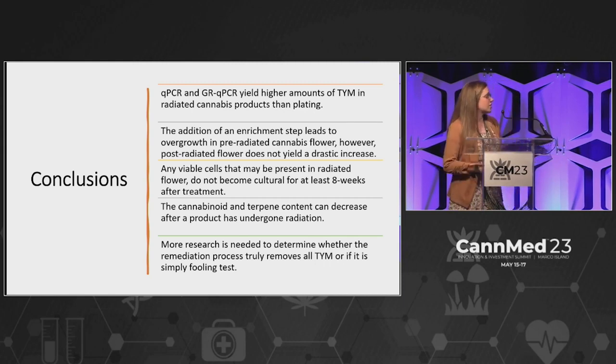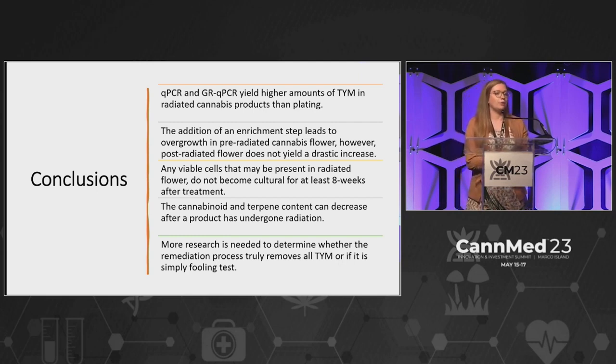And then more research is needed to determine whether or not this remediation process is truly removing all of the total yeast and mold, or if it's simply fooling the test. So that's the big takeaway here: is remediation able to actually fix our product, or is remediation just figuring out a way to trick the test?